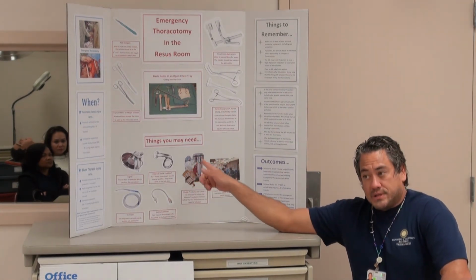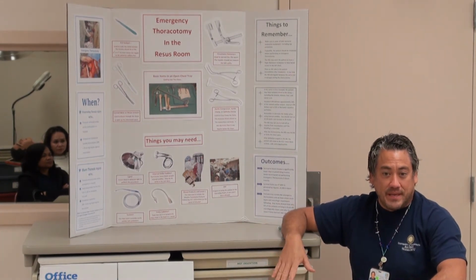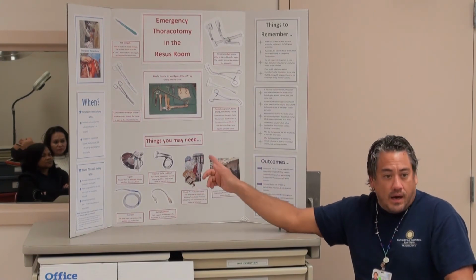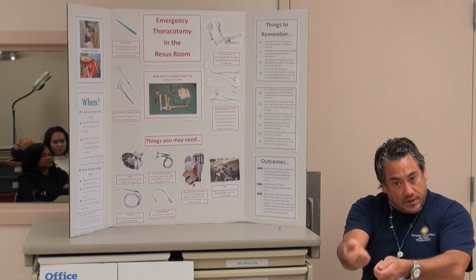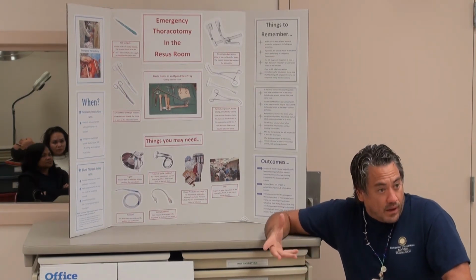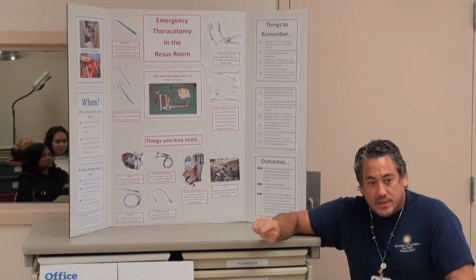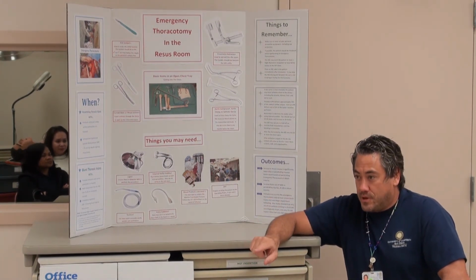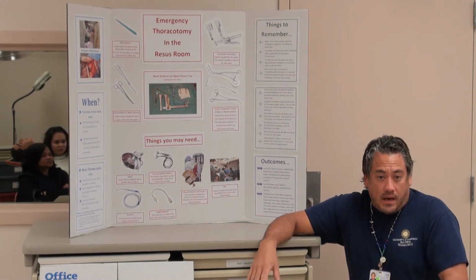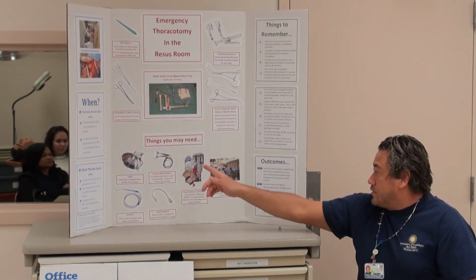Remember the internal defibrillator paddles. Right now they're kind of sitting on top of Pete's cart. I think both sets are sitting there. So if you have to use those, you give them sterilely, and they'll give you the end that you put into the Zoll. Remember to decrease it, because all the defibrillators automatically go to like 120. So you need to make sure to decrease the energy before you fire away with those. You usually start at around 10. Docs will say start at 10 joules, and then increase from there, and the max is 50 for internal paddles.